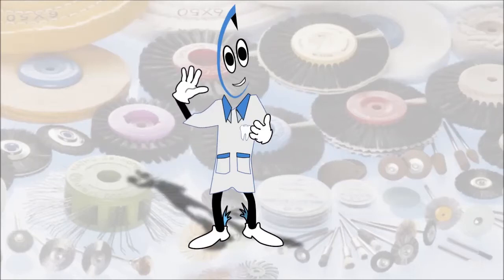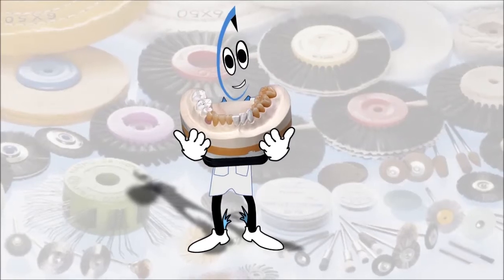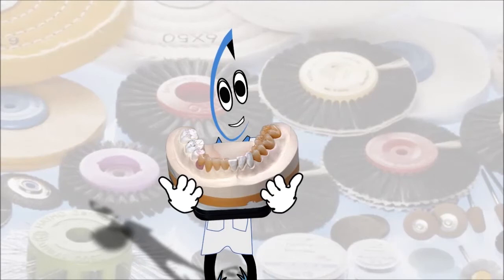Welcome to Hato! My name is Rotilli and today I will show you the quick high shine polishing technique of ceramic and zircon with diastones and the Polystar Pro diamond paste.